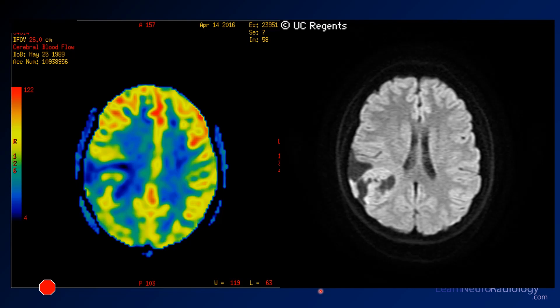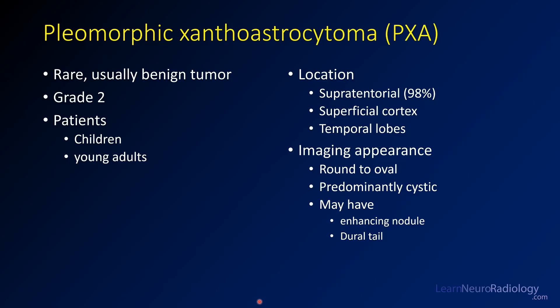DSC perfusion shows relative hyperperfusion centrally — not super hyperperfused, but just a little — suggesting it's not too cellular but relatively hyperperfused. This is a pleomorphic xanthroastrocytoma, or PXA. These are rare, usually benign grade 2 tumors that tend to occur in children and young adults. Most commonly they are supratentorial, involving the superficial cortex, particularly in the temporal lobes. They tend to be round to oval, have cystic components, and characteristically may show a dural tail, as well as a prominent enhancing nodule.